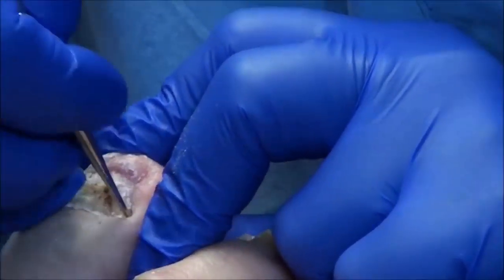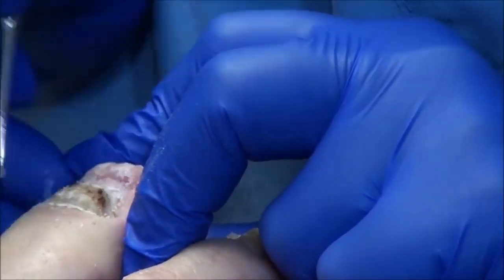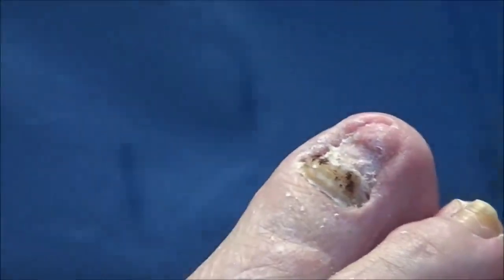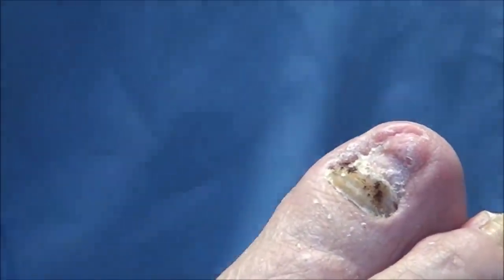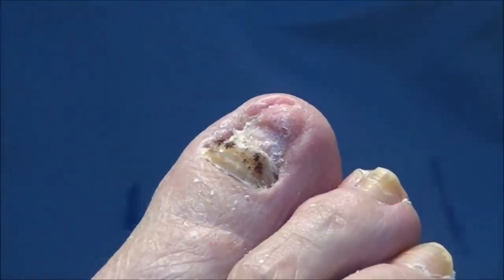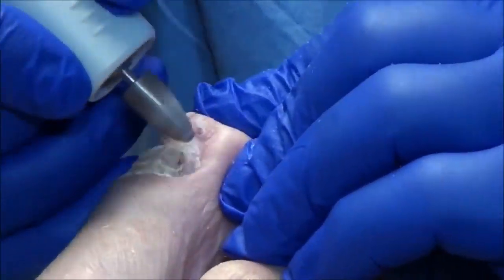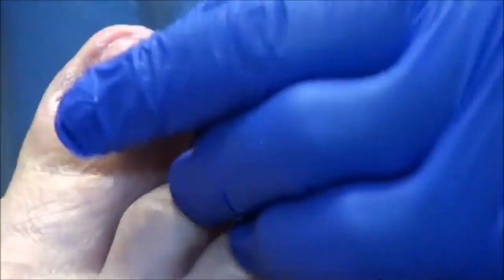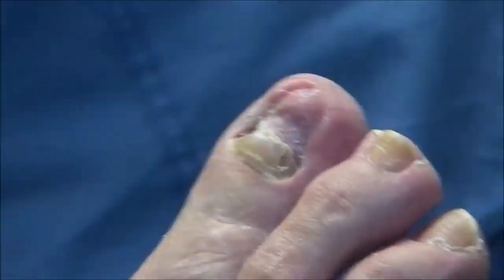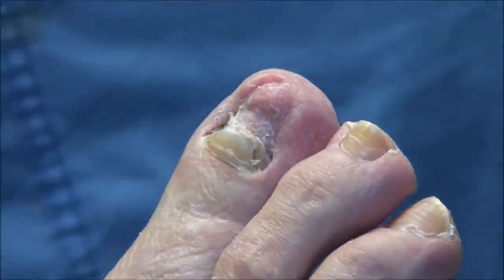Yeah. All right, so I'm going to take my little drill, which as a dental hygienist will sound horrifyingly similar to. As long as it's not the Cavitron, that's what I ever used. Okay, so I'm just going to smooth it out and thin it out a little bit. I just didn't want to leave any sharp spots on it. But it looks really good.